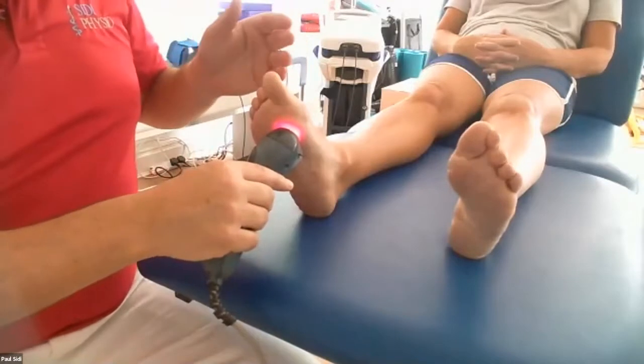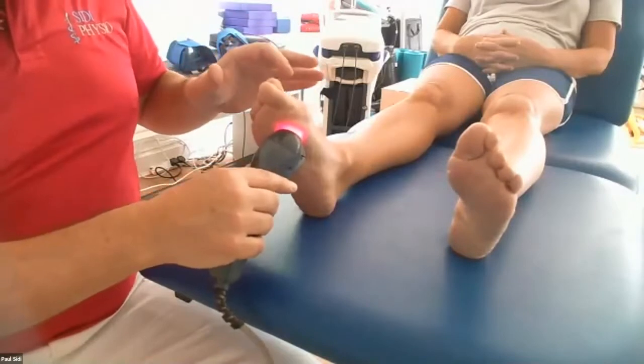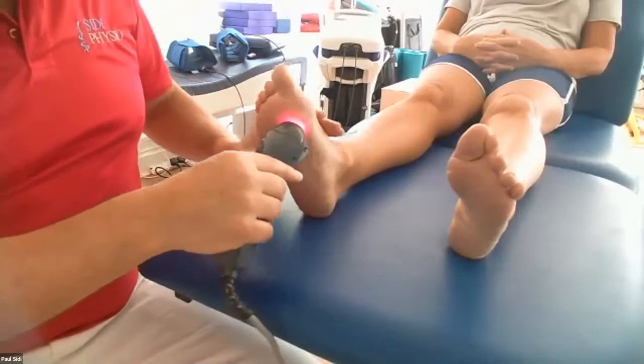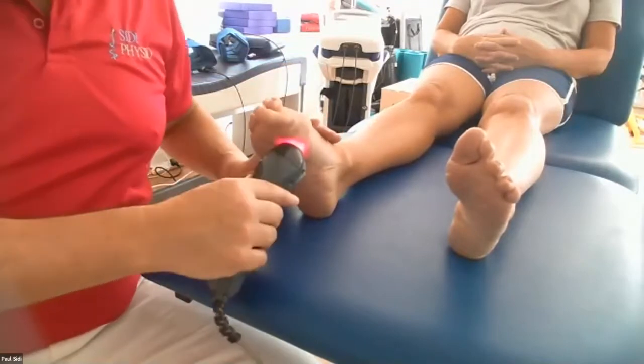Let's say this was the second treatment, or even the third treatment, definitely. I would start moving this toe. Can you bring it down? Okay, and bring it up. And get moving this thing. So we're actually working that flexor hallucis brevis. Keep it going, which is helping with the repair on here.